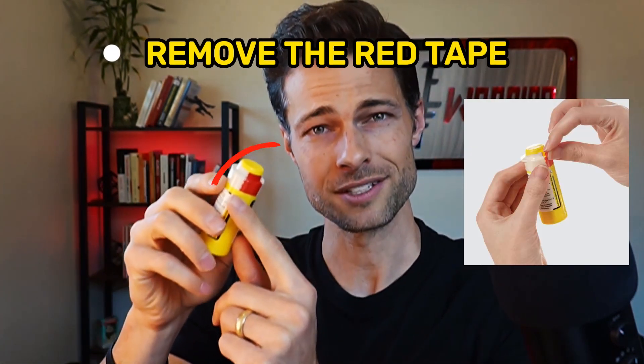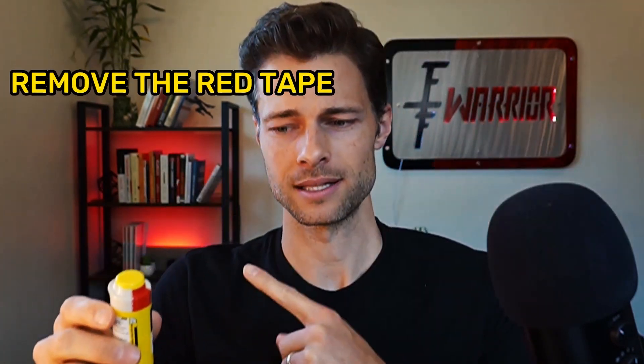The first step according to the website is to remove the red tape. I'm going to put the instructions on screen as well. This is exactly why I spent a minute reading through instructions — you're not going to have a minute in an emergency situation. So the first step is to remove the red tape, and I'm going ahead and peeling it off.